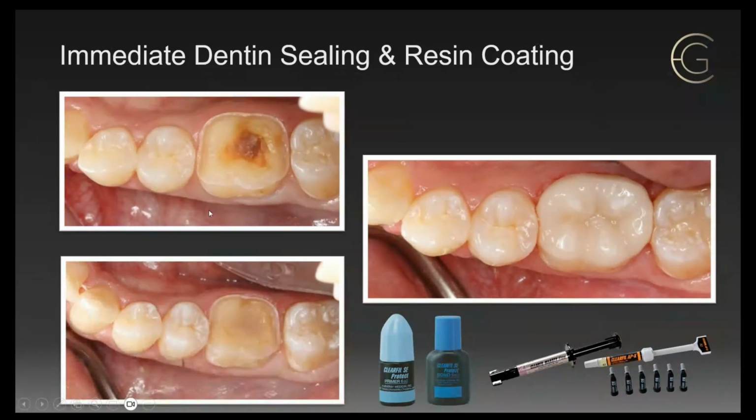Yes, sir. Dr. Campbell, we had a question about, you said light cure for 20 seconds or 30 seconds. Are all light cure wands created equal? No, they are not. So I was using the Valo, and that's the one I use for that. But I'm a big fan of the Ivoclar Bluephase light.